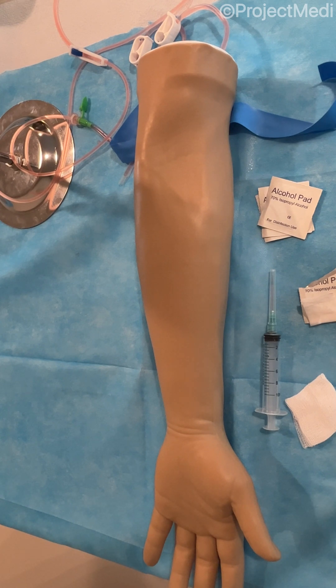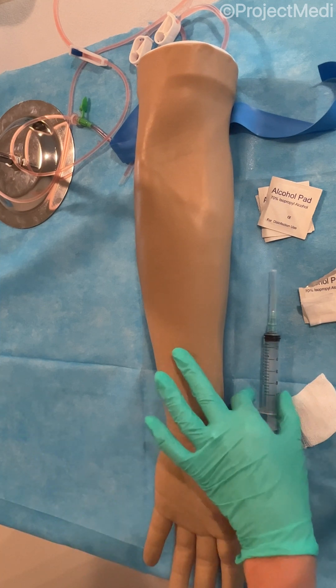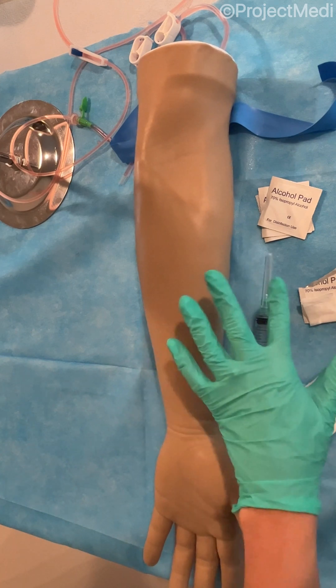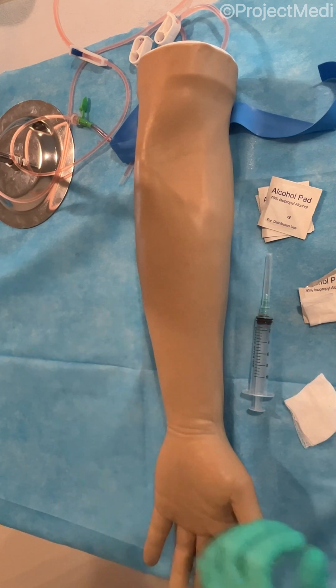We can start by sanitizing our hands and then donning gloves before we proceed with any blood draw. With the model assembled and the IV tubing ready to go, we can ensure that we have our syringe ready with the straight needle attached, alcohol swabs, tourniquet, gauze, and the IV tubing ready to go.